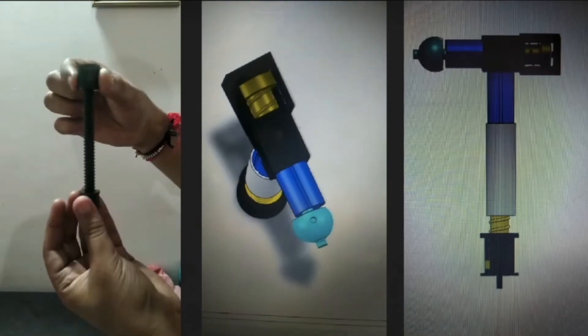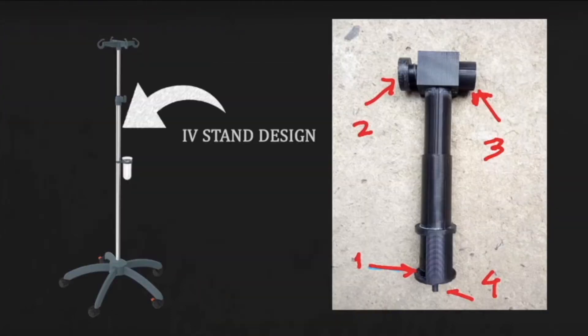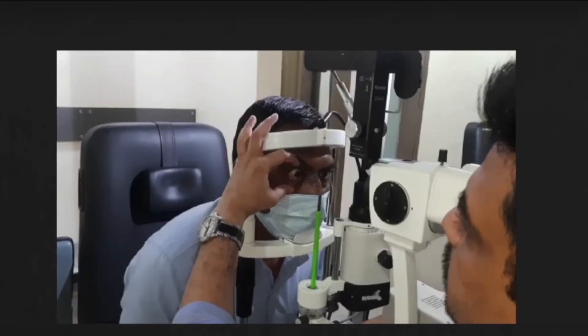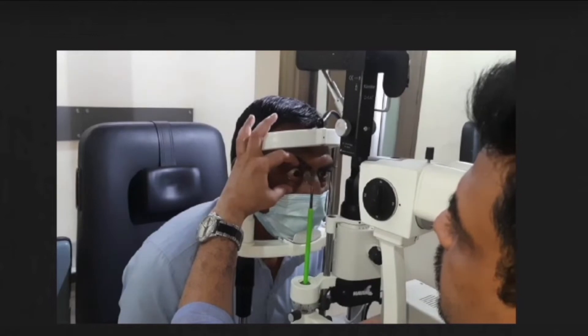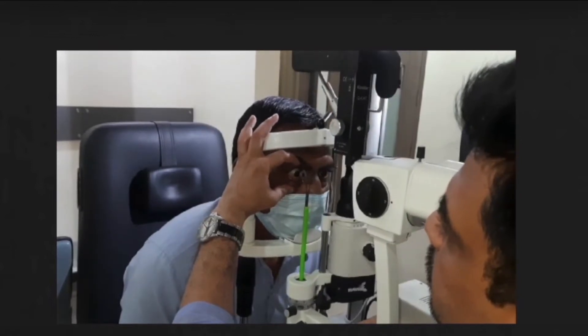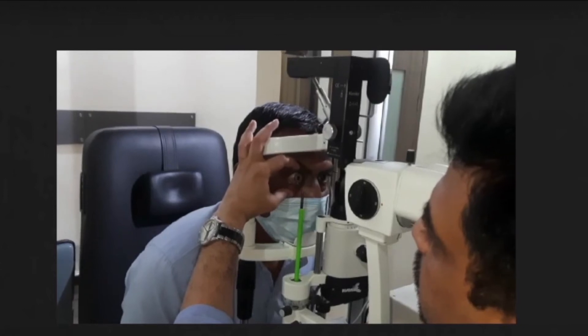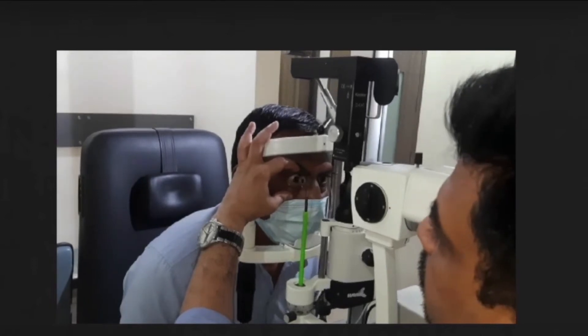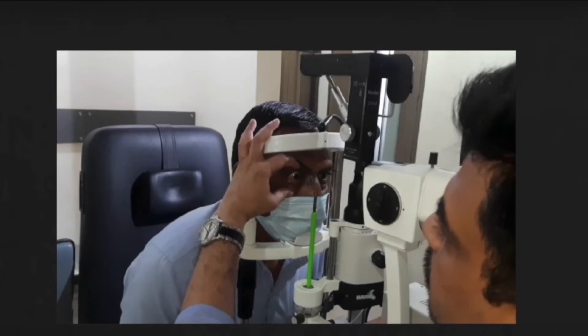Thus we finally settled with a shaft within a shaft, that is the IV stand design. Now coming to the first prototype of our device. As you can see, we have implanted it into the calibration slot of the slit lamp. With the help of the knob of the slit lamp, we move it ahead. It goes and indents the cornea at the desirable axis. Again with the knob, we take the slit lamp behind and it comes back to its original position.